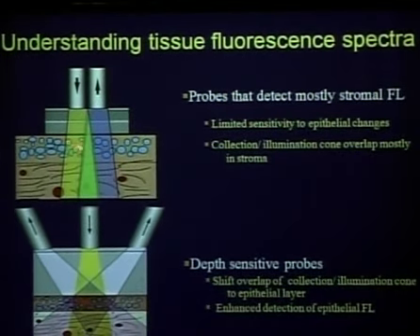And this just illustrates with traditional probes where you have fibers that are pointing straight down at the tissue, the region that you're collecting light from is the region where these cones of light from the fibers overlap. And either with the ball lens or using an angled geometry, as other people have done, you can confine the region of overlap more to the epithelium.